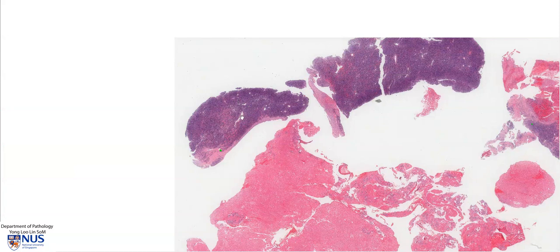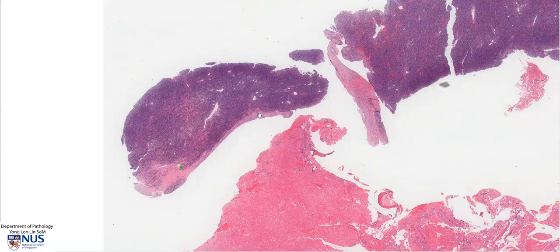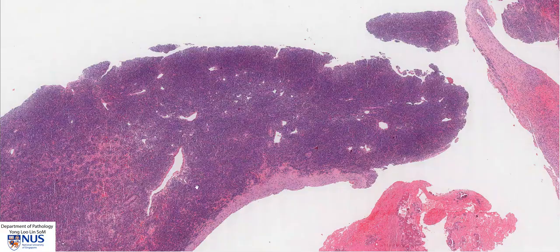Plasma cell myeloma comes from a spectrum of plasma cell neoplasms. In myelomas, these tumors are multiple and they involve the bone marrow. However, there can also be sometimes solitary tumors, and these are known as plasmacytomas. These plasmacytomas can be in the bone or they can be extra-osseous. This is taken from a case of multiple myeloma rather than a plasmacytoma.